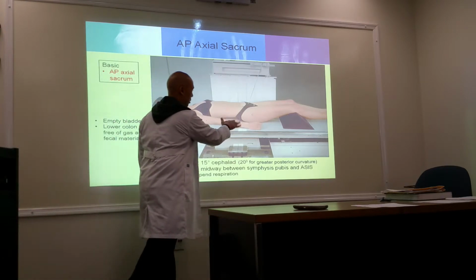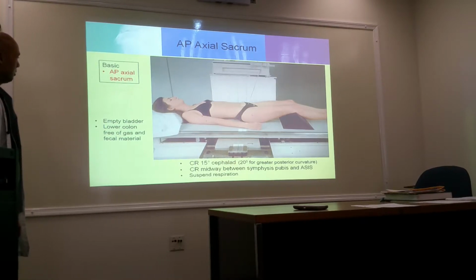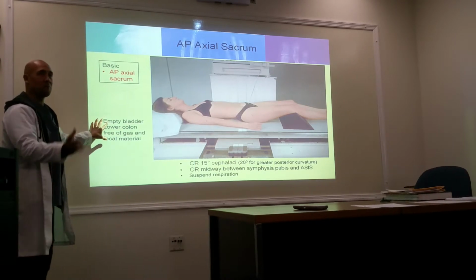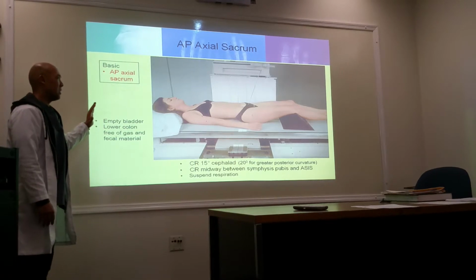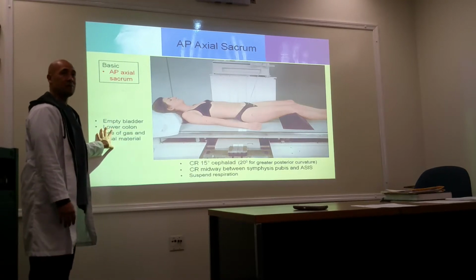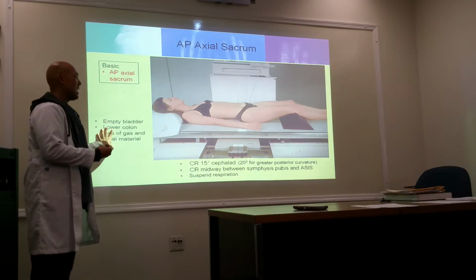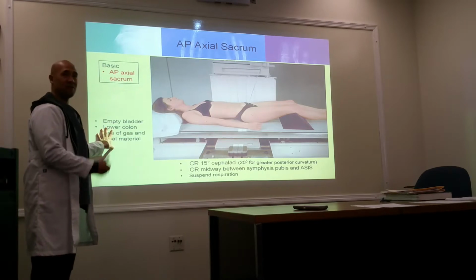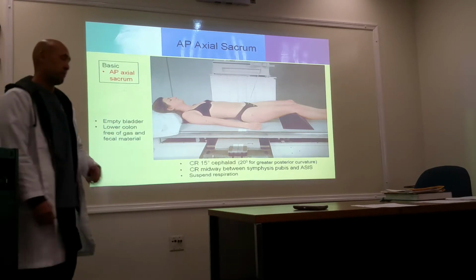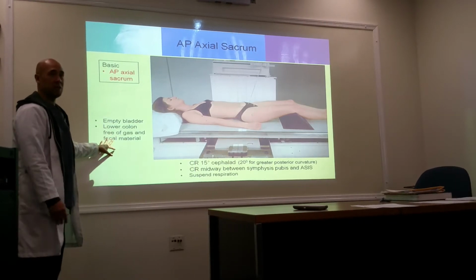Also, by bolstering their legs, it will help straighten out the sacrum a little bit better to put it in true profile. Now, this is one of the criteria, and it isn't followed, but it should be that if it's a focused study on the sacrum or the coccyx, there is a prep that is suggested. The bowels have to be empty. Because you have the bowels overlying that area, and fecal material can show up as some kind of anomaly on the bone. So we want to try to get rid of any gas or any type of content in the bowel as well as the bladder. So they got to empty out before you do the shot.